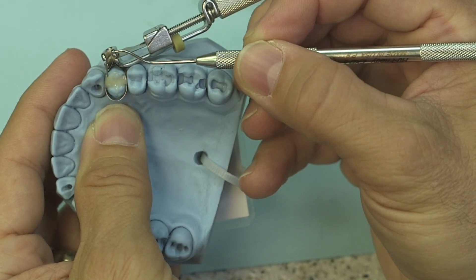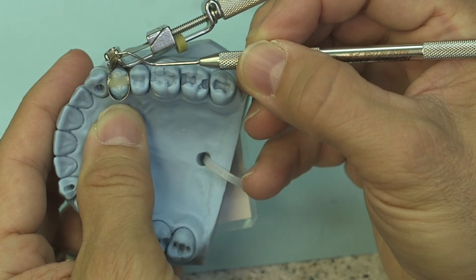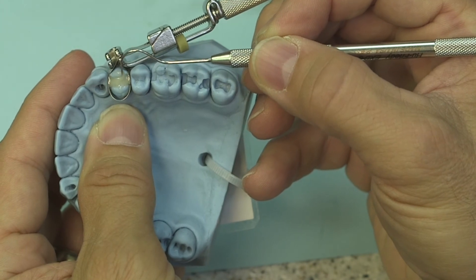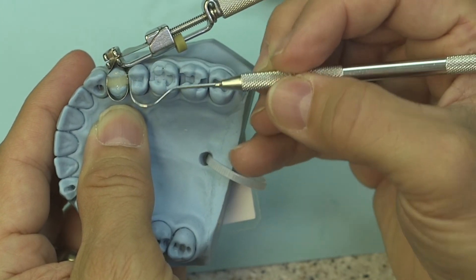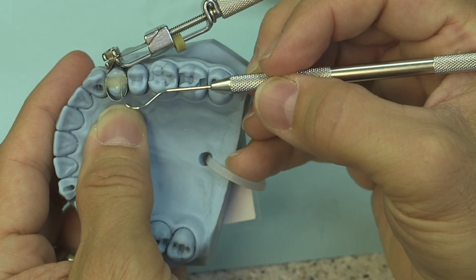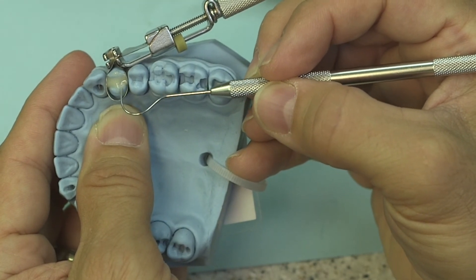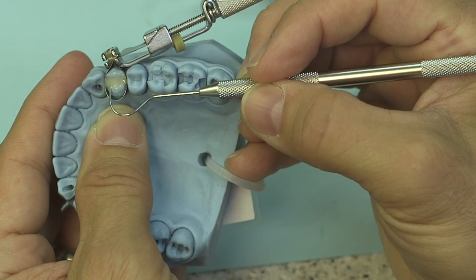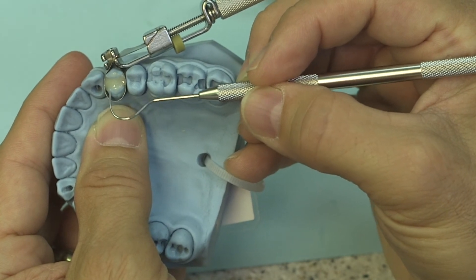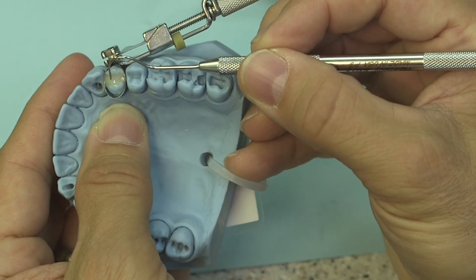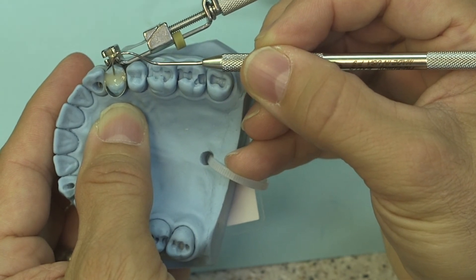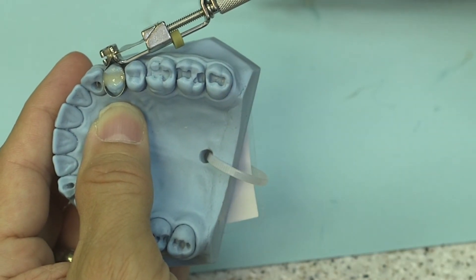For your anatomy after curing, you can use whatever rotary instrumentation you would normally use for your regular composite procedures and polishing to bring out a high luster on the composite of the Activa. I'm just kind of bringing it all around because I'll be able to create anatomy in there after I have finished curing.